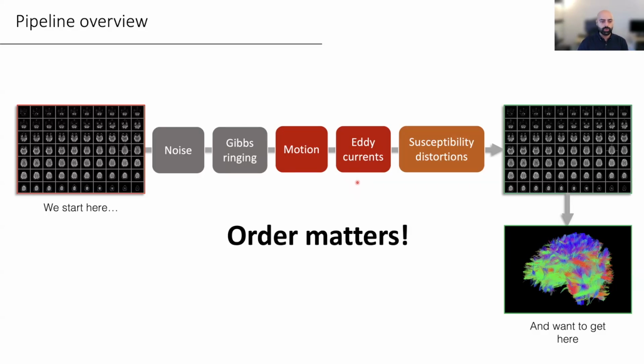It will give you just wrong outputs and bad outputs. Even if you don't clearly see it immediately, the statistical properties in the image have now been altered so that the noise estimation, which requires really dealing with the raw signal, is no longer valid. So if you want to do denoising or any of these corrections, make sure you do it at the raw data level before the rest of the pipeline applies.